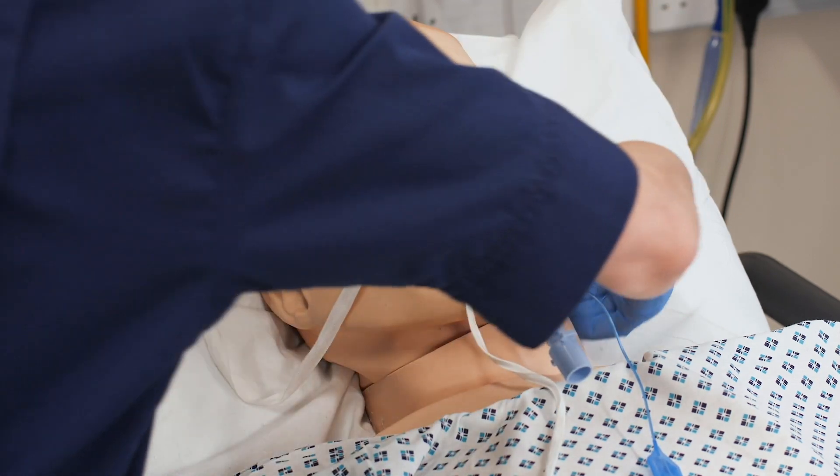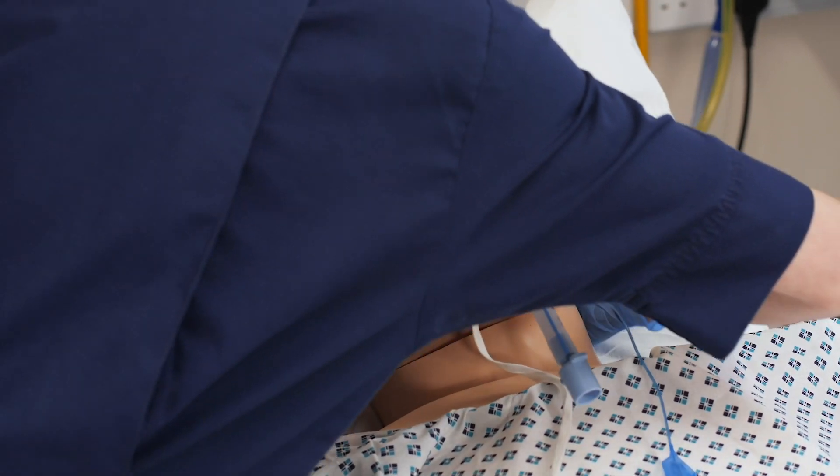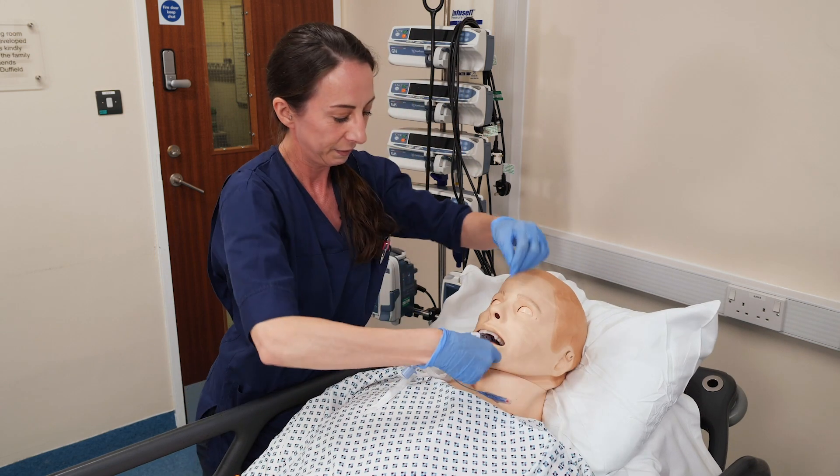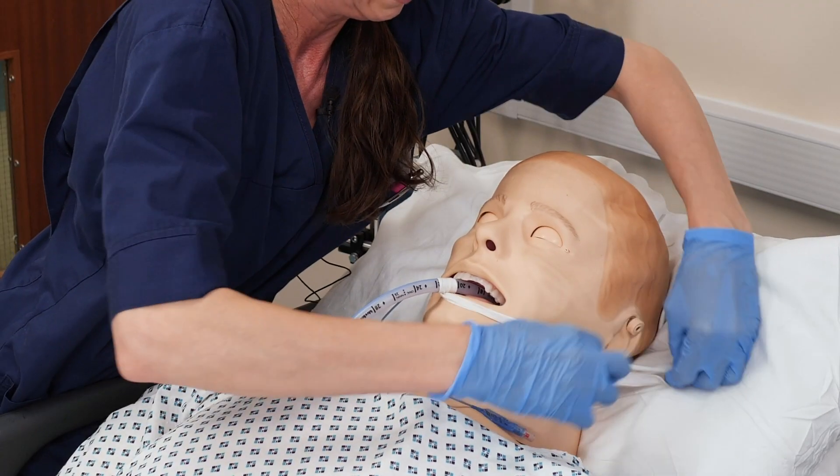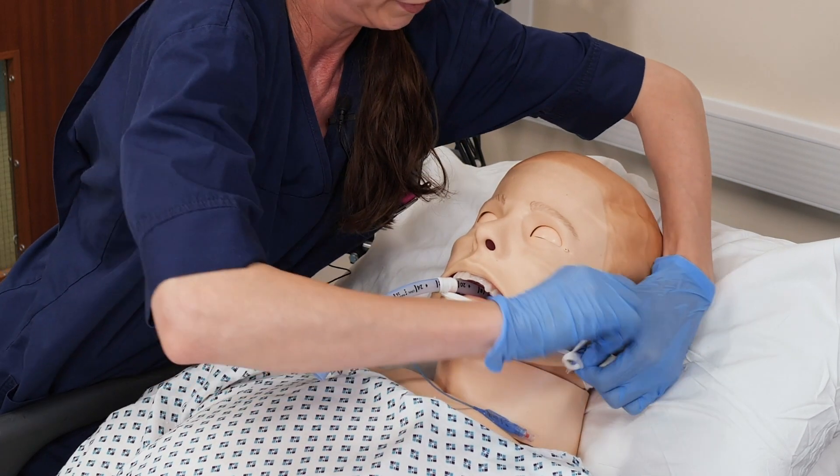Bring the ribbon through the other side of your patient's head, and then just tie. Tie in a bow any way you like.